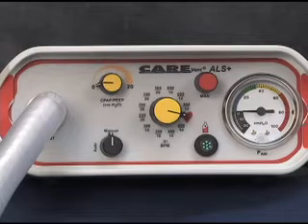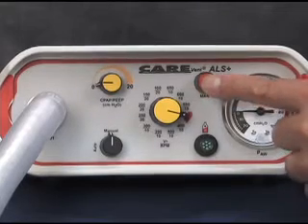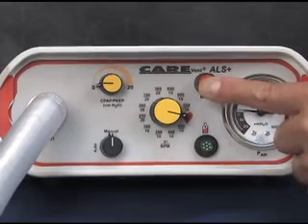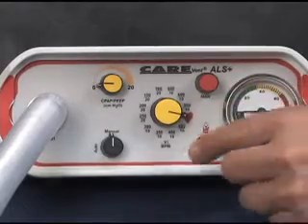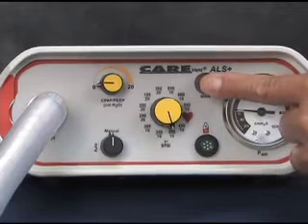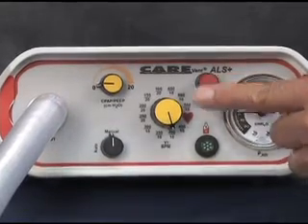The manual position will allow the operator to provide manual ventilations using the manual override button. These manually actuated ventilations can be used to support a patient in respiratory distress, or to provide manually triggered ventilations to a non-breathing patient. The flow rate provided by the actuation of the manual button is equivalent to the pre-selected automatic setting on the rotary setting selector control.